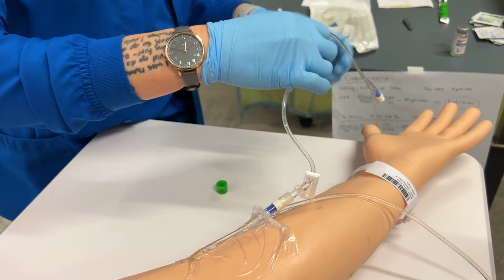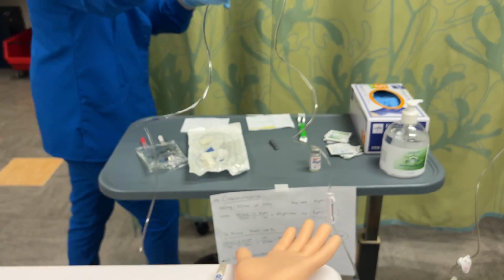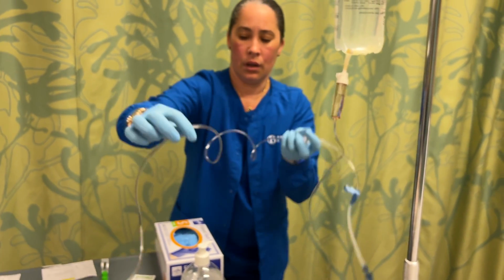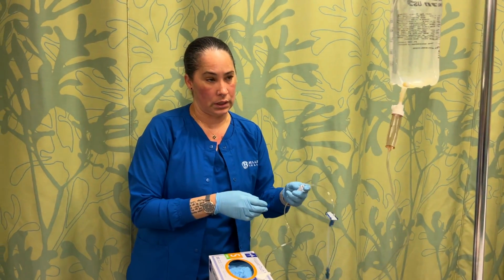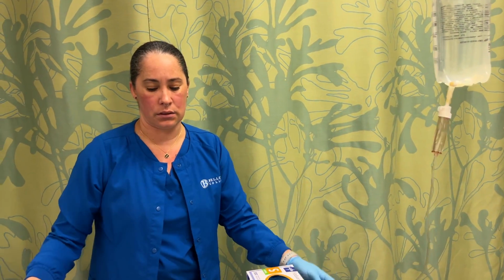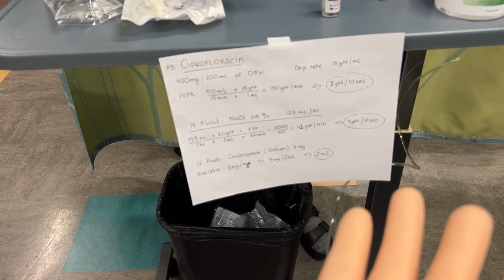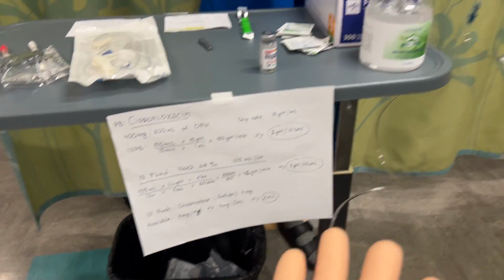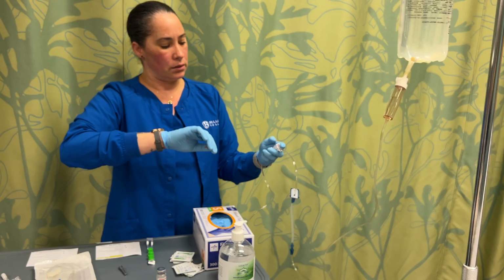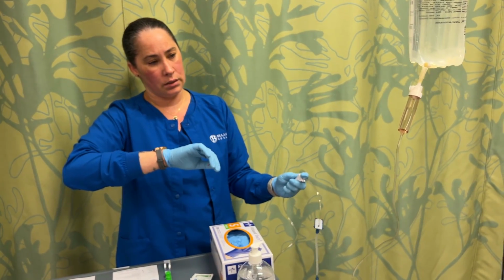Last one we're going to do is go back to our other clamp that we closed. And we are going to set this at 7 drops per 10 seconds. As you can see, our little cheat sheet here shows that that is the rate that we're going at. So you're just going to look at your watch for 10 seconds, and you just want to make sure that it is going at the rate.